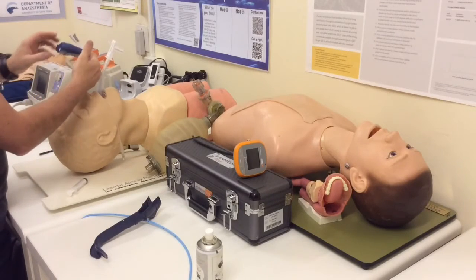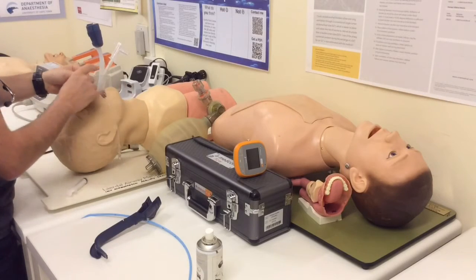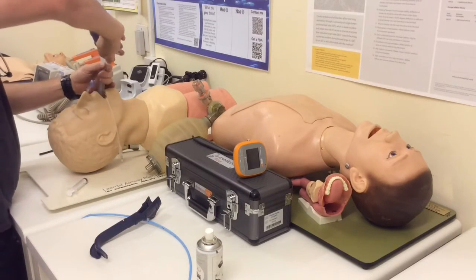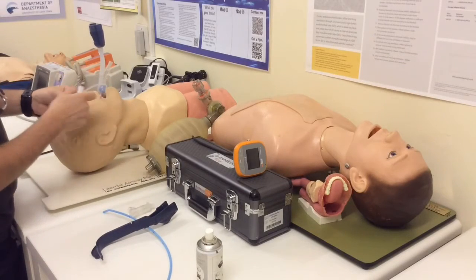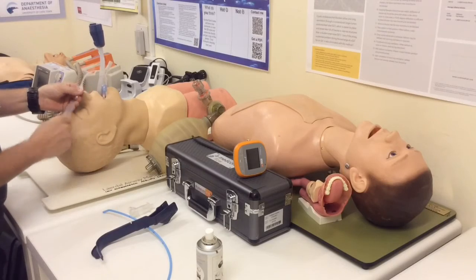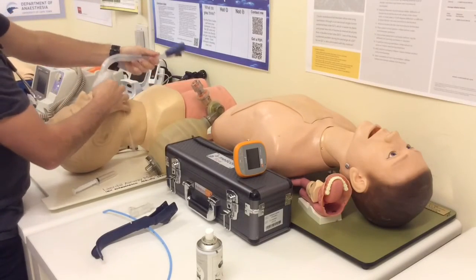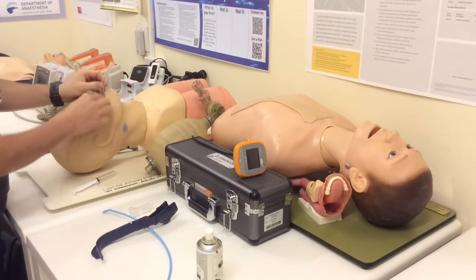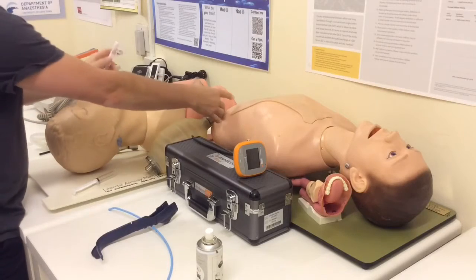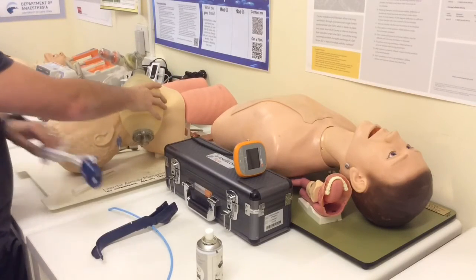If I wanted to, I could cut off this battery pack and dispose of it. If I really want to, I can take out the whole supraglottic airway portion. So I disconnect my endotracheal tube connector. I make sure that my LMA cuff is deflated, and you'll see that this has got a channel on the side here, so I can hold the tube in place, get a hold of it over there, or I can get rid of the supraglottic airway completely, put my patient back on the ventilator, and we're good to go.